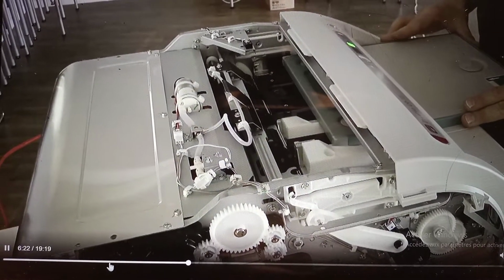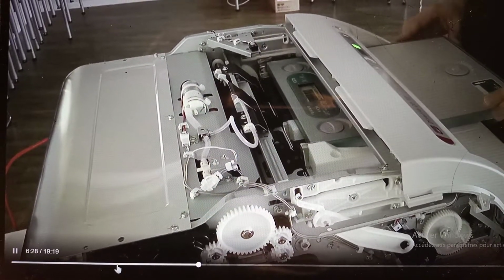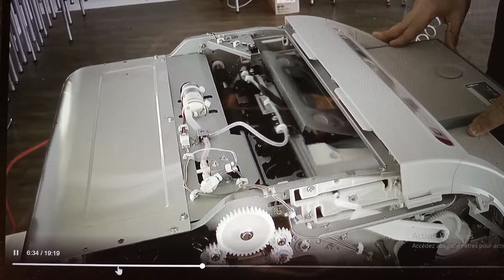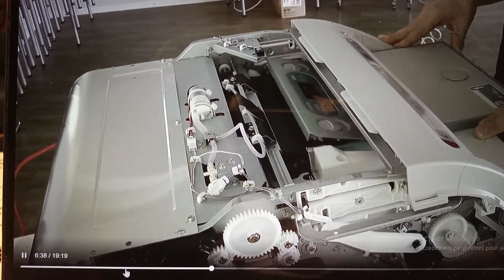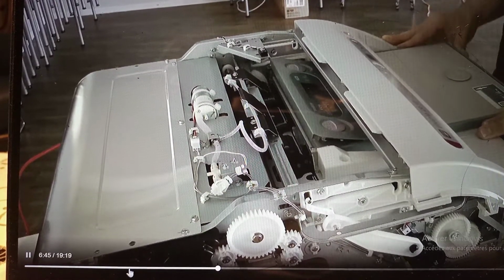And when you press in the cassette, it will be unlocked with these knobs, and I will show it now. So the cassette will be open. One arm is picking up the image plate, inserting it in the readout unit, and now the image plate is being read out.